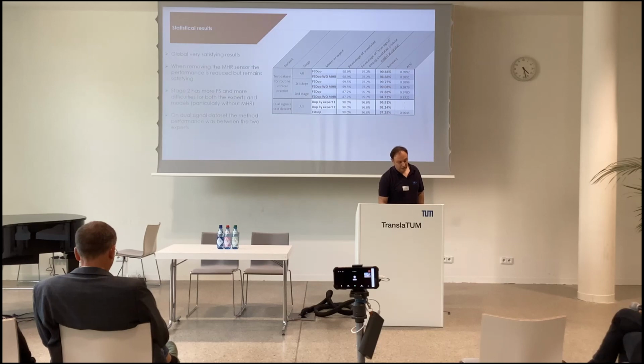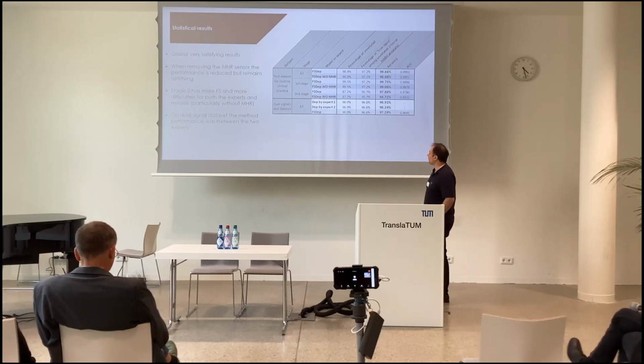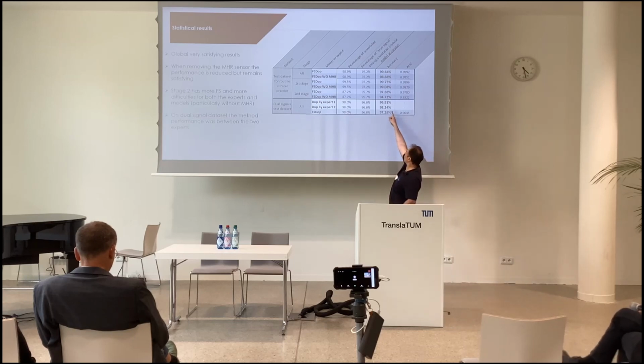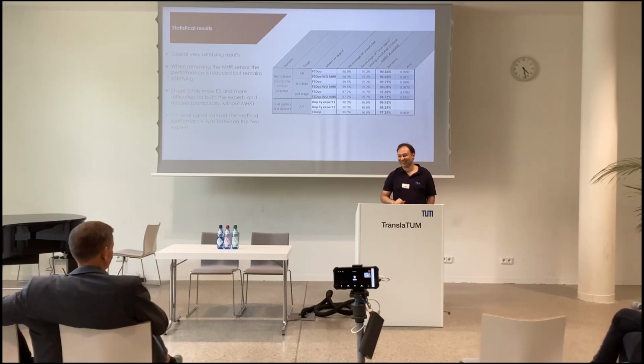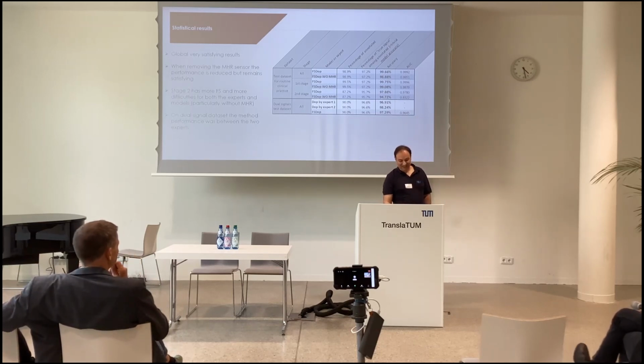On the dual signal test dataset, we can see the performance of the two experts and the performance of the method, and the method was between the two experts. So it fits the impression we have that the method is as good as most experts, but if the analysis is by very well trained experts, like Antonia, they can do a bit better.